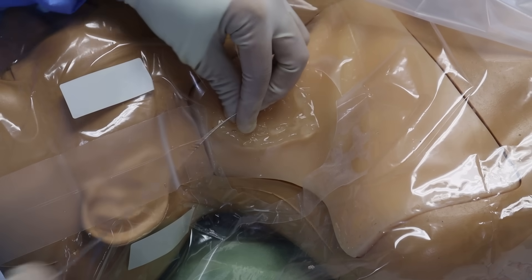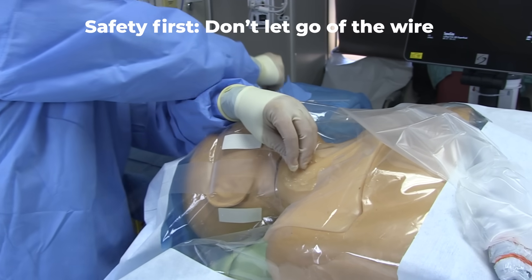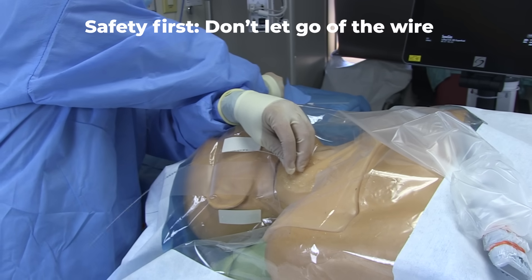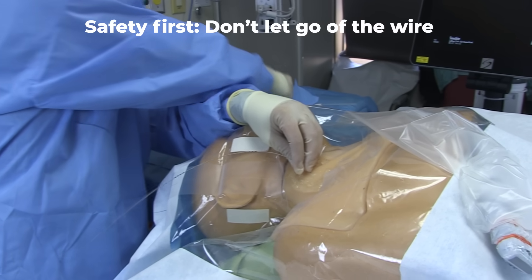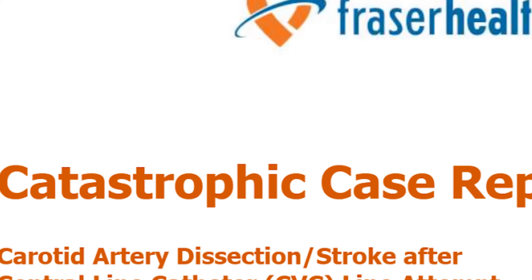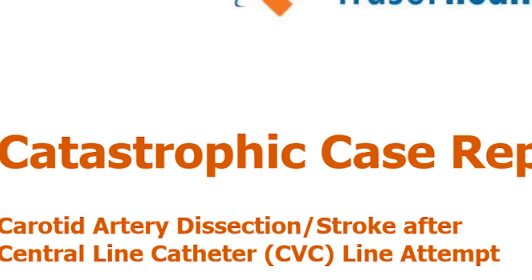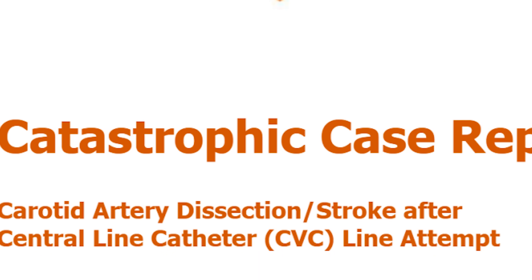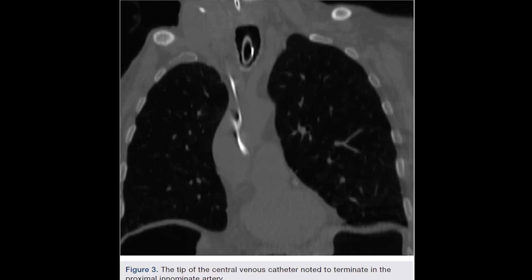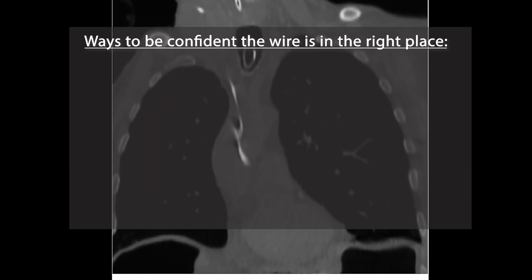From here on out, one hand should always be controlling the wire until it is out of the body. Otherwise, there is the rare chance it gets totally sucked into the vein, and that will be an embarrassing call to vascular or cardiothoracic surgery. Now is a good time to confirm placement of the wire. If you accidentally wired up the carotid, it's not too late — you can still remove it and hold pressure for several minutes. But if you go to the next step and dilate the carotid artery, you will need to call vascular.